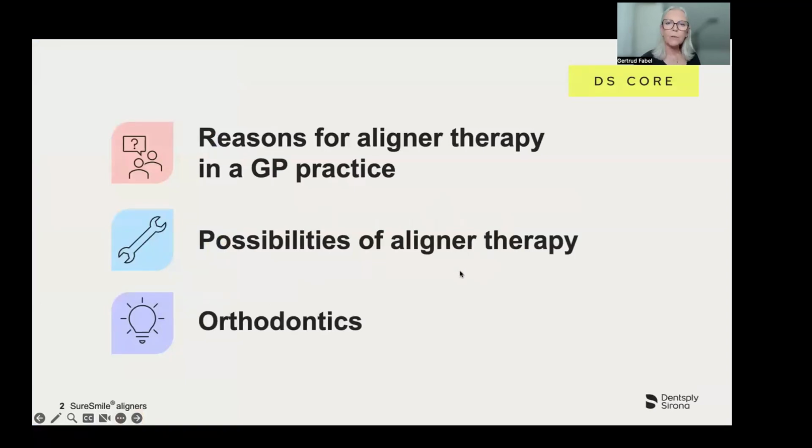We want to also talk about the possibilities of aligner therapy. In implant cases, the opening or closing of gaps leads to a reduced number of implants, or in contrary, makes implantation possible.